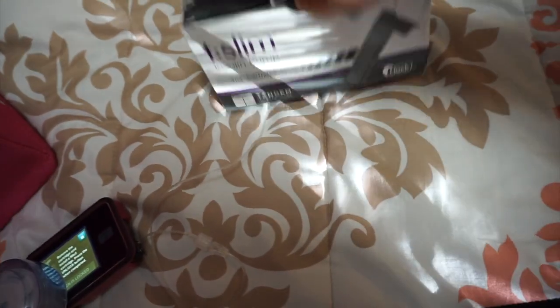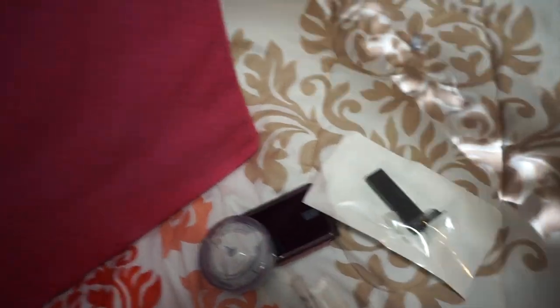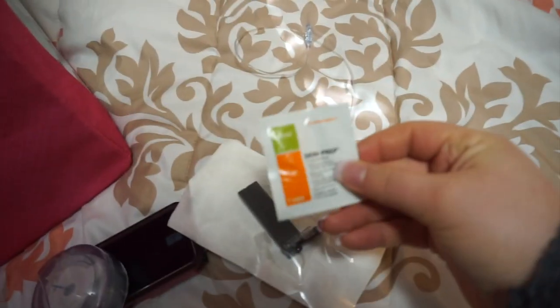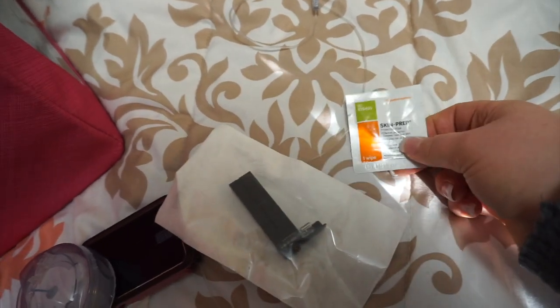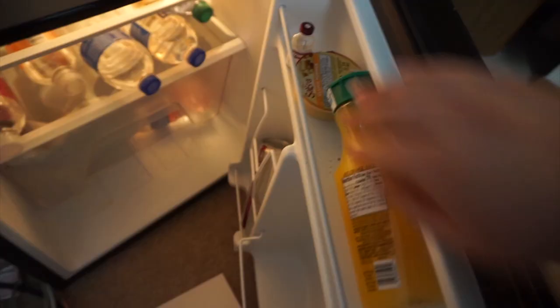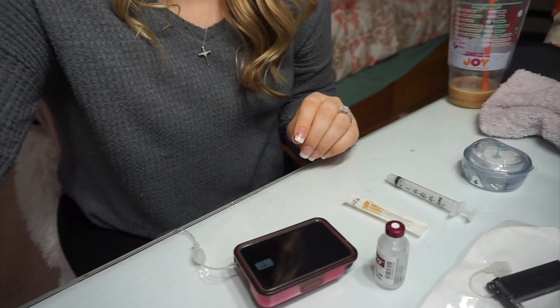Then I need a cartridge where the insulin goes in, and a needle to get the insulin into the cartridge. I also need a prep pad — these are the skin prep pads by Smith and Nephew, and they are what you use to disinfect and create a more adhesive surface on your skin. Then I need to grab the insulin, which has to be refrigerated. I use Humalog, which is just a form of synthetic insulin that my insurance covers. Now that I have all the supplies laid out, I'll walk you through this.